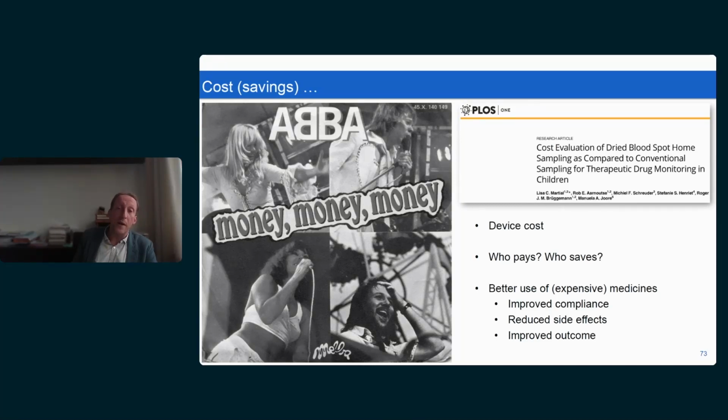And if you can really show that we have a better outcome when using actually just the same medication in these patients, this could really demonstrate to the financiers, and this could be Social Security, for instance, that microsampling is really cost beneficial.